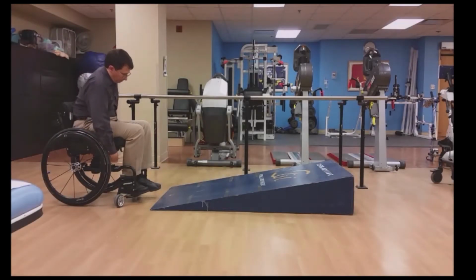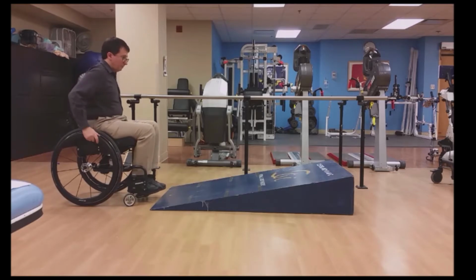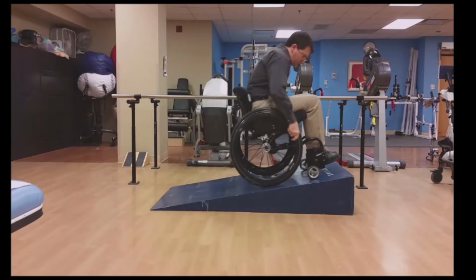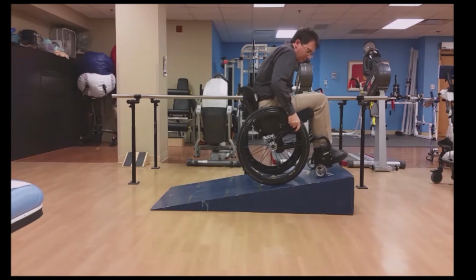So I wish I had the capability on this chair. And back in 2015, Jamie Borisov and I talked about dynamic wheel mobility, which is having on-the-fly configurations like this, and we still both feel very strongly chairs should have that. And if you happen to see Jamie, he's around here and he presented yesterday. His chair, the Elevation, is the only chair that actually does that right now.